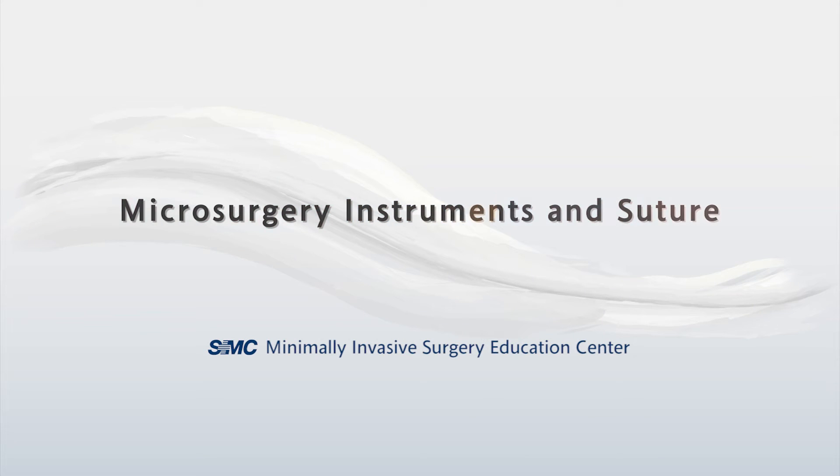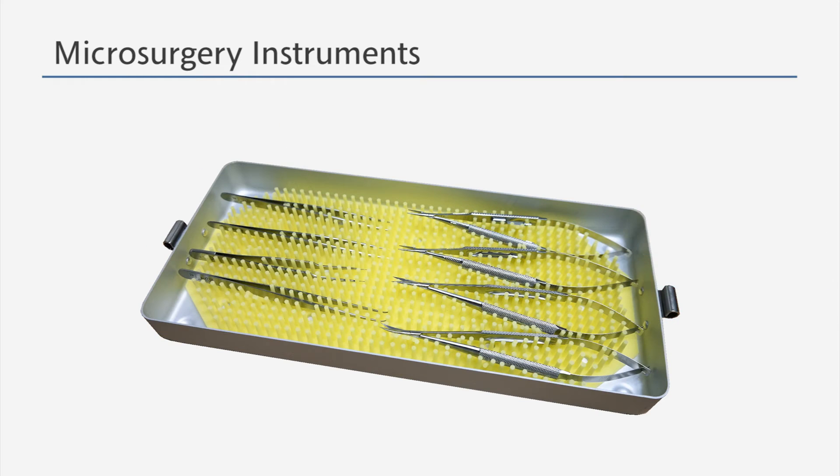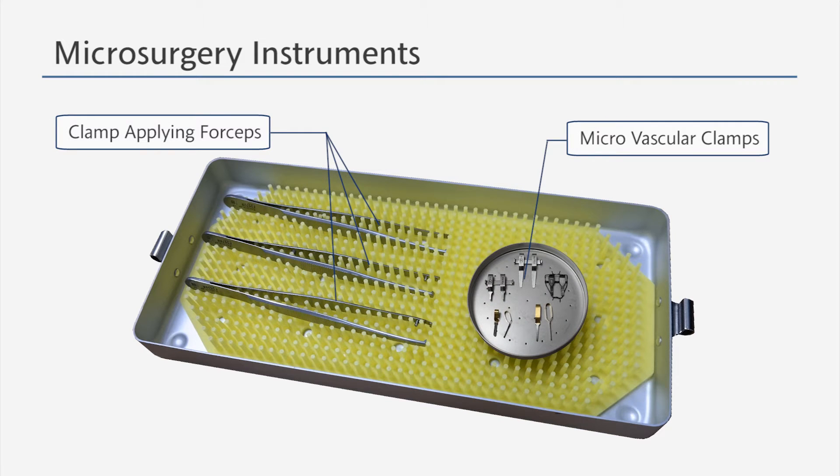This is the training on the microsurgery instruments and suture. We will start with the microsurgery instruments. When performing a microvascular anastomosis, the following microsurgical instruments and vascular clamps are used. Let's look at each one of them in detail.